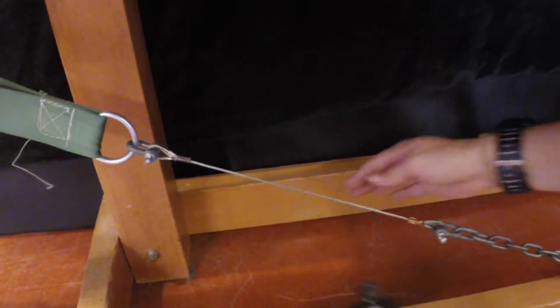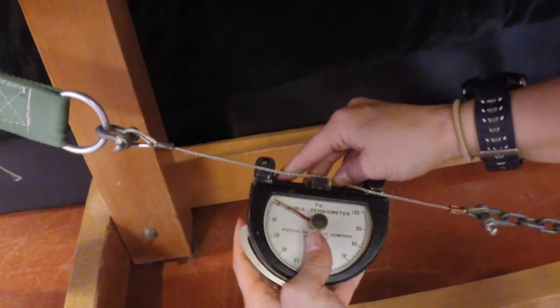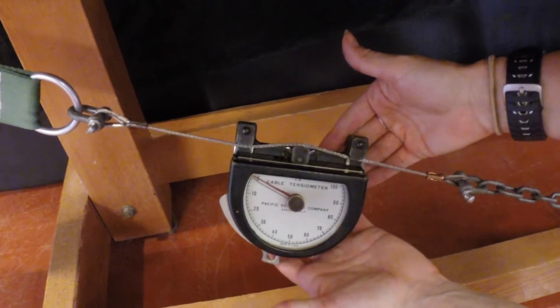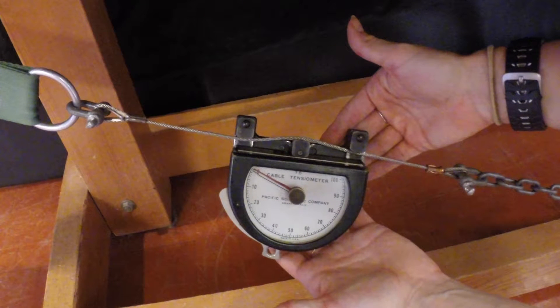Now attach the cable tensiometer to the cable underneath the table. You'll have to ask your client to take the tension off the cable in order to put it on. The cable should pass below the two outside plates and above the middle plate. Make sure to always hold on to the cable tensiometer because if there's no tension in the cable, it'll fall off.